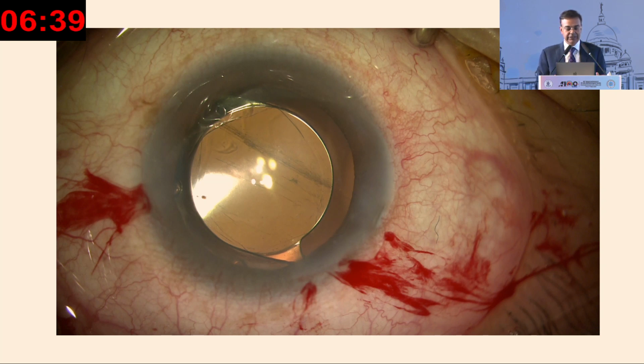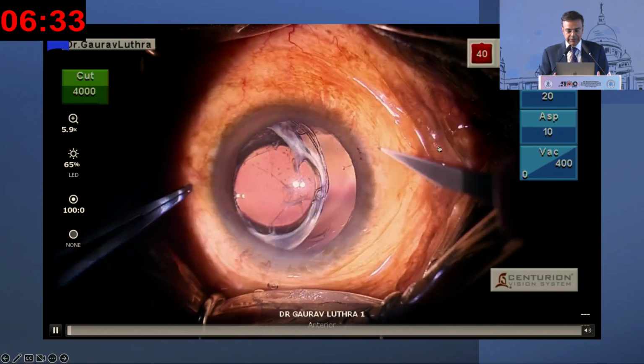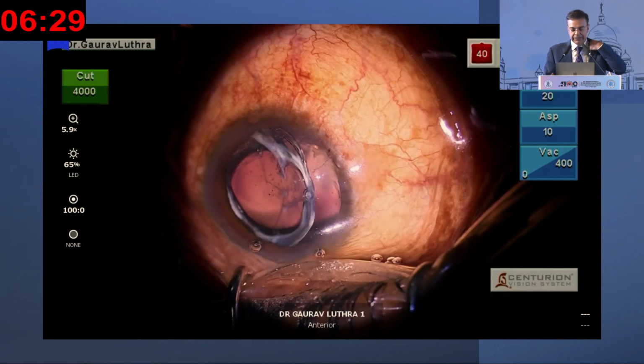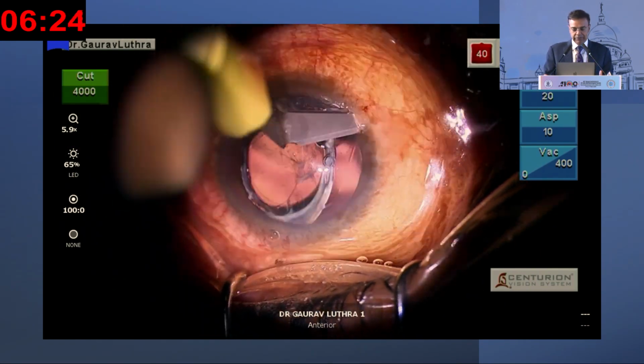And I finished the surgery in 5 minutes. She thought I'd done nothing, and she was not convinced that surgery was done. So this patient presented to us. You can see there's a CTR in the bag. The whole capsular bag complex has dislocated. I decided to refixate this bag complex.